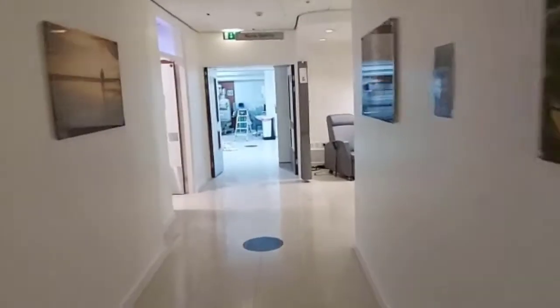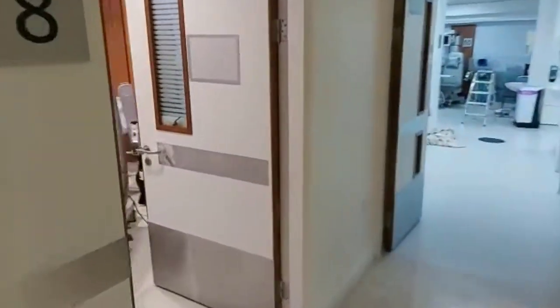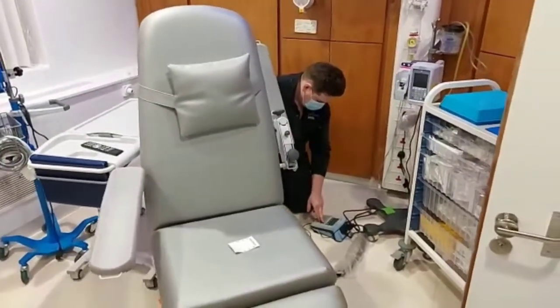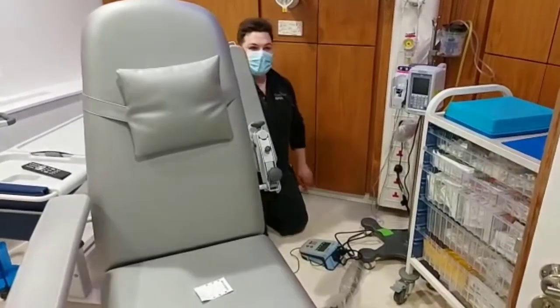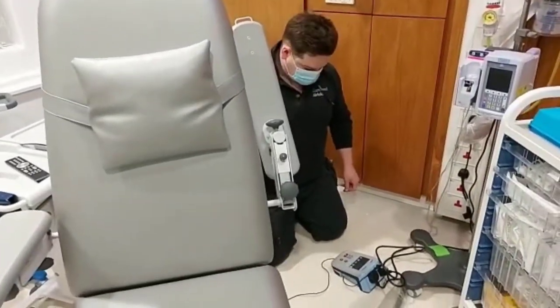I'm walking down an empty corridor in the middle of the night at a private chemotherapy suite in Manchester. I'm going to ask Robert why we're doing electrical safety tests on these chairs and not just a standard PAT test. Robert, take it away.